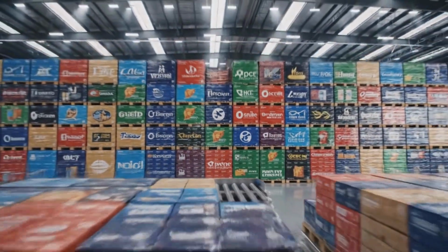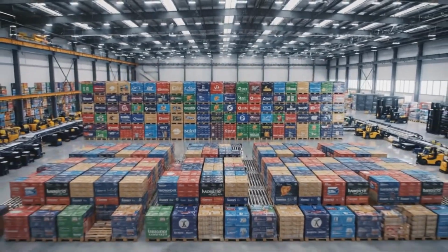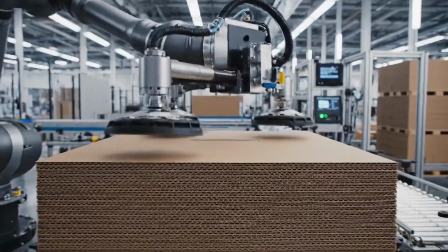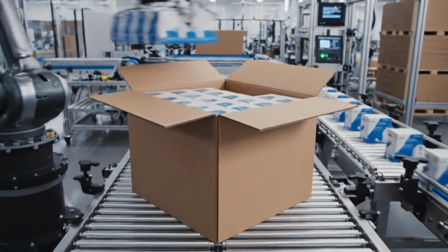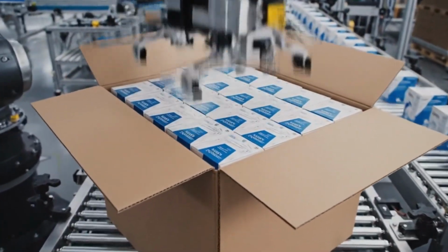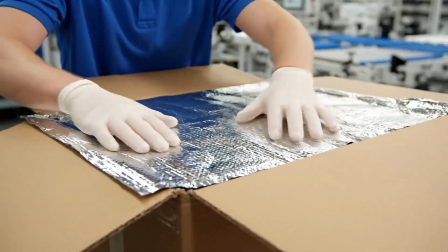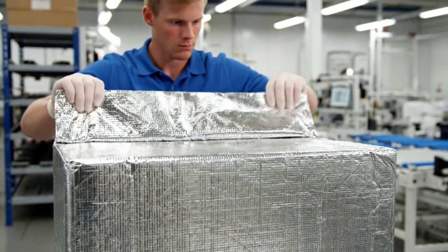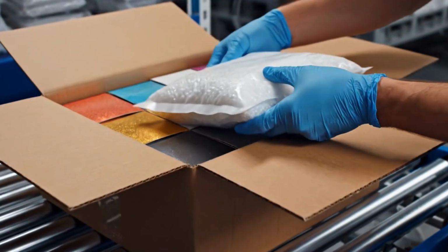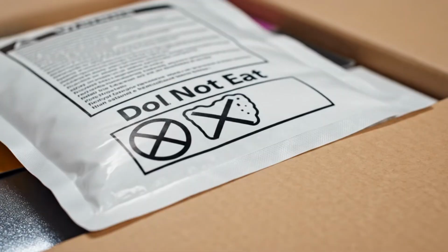Phase 8 is complete. The product has a face, a voice, and a global identity. Protecting a medical product requires more than just a box. It requires a fortress. Our master cartons are built for global endurance. Latex is sensitive to heat. We use thermal shielding to ensure that the cool factory environment travels with the product. Moisture can ruin packaging. These desiccants act as silent guardians, keeping the environment bone dry for months.